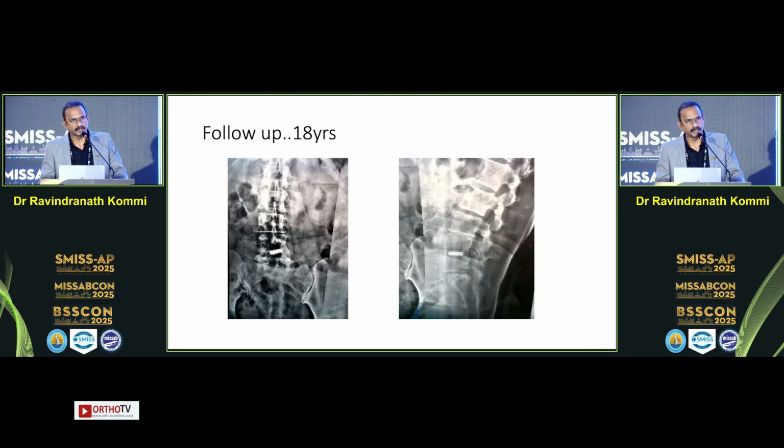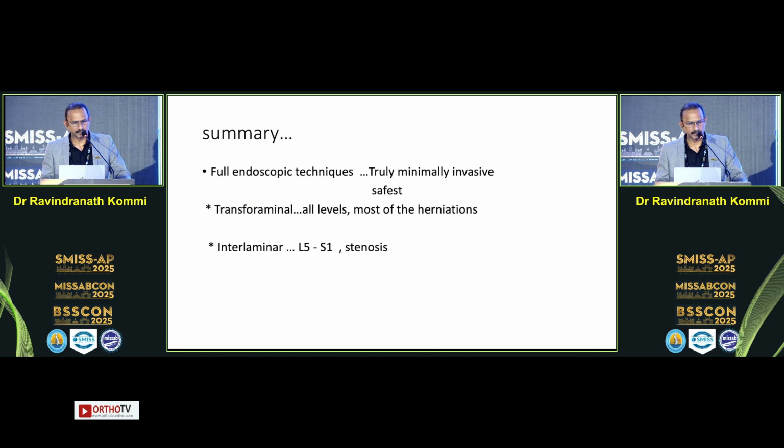And this is one of the follow-ups of 18 years. This is Dr. Gore's slide, who had performed this surgery 18 years back, and this implant was not available, but now recently, last month, we have started using it again. Now this is manufactured in India.